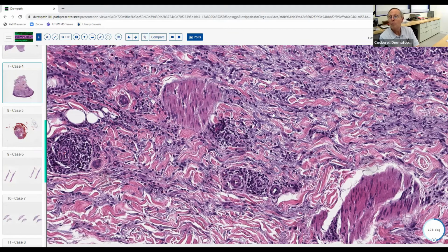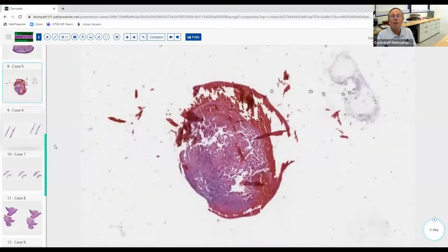So just remember that. There are a few other things that can look like interstitial histiocytes but are not. Metastatic carcinomas like breast cancer can give you a mostly interstitial pattern. Kaposi sarcoma, plaque stage KS, can also give you a mostly interstitial pattern. Metastatic breast carcinoma might give you mucin, but KS would not give you mucin in that situation. There are a couple of things to remember in the differential diagnosis.